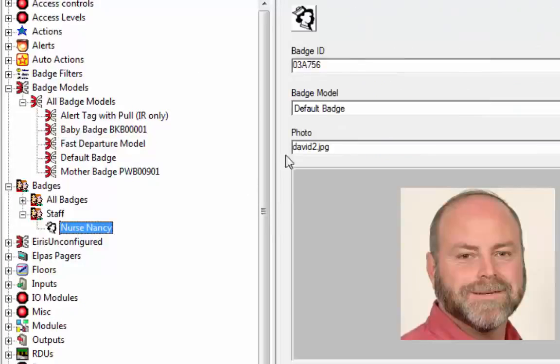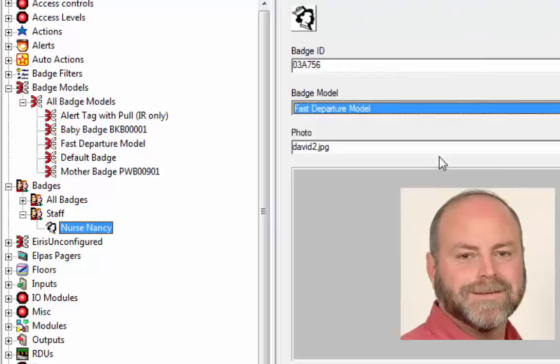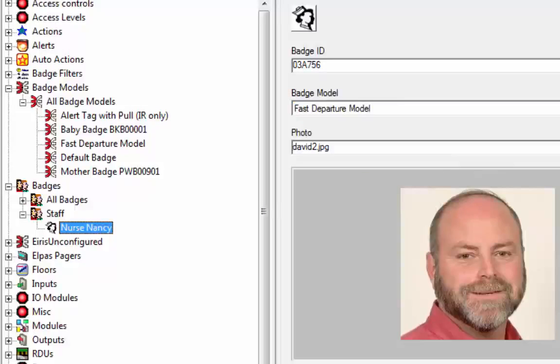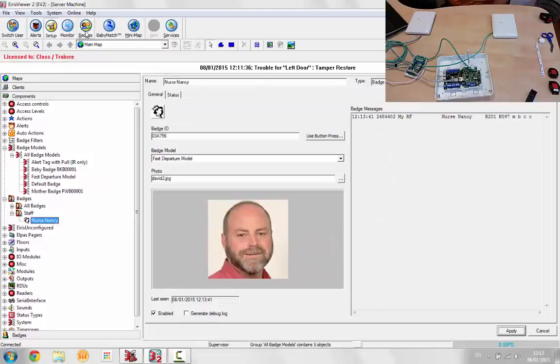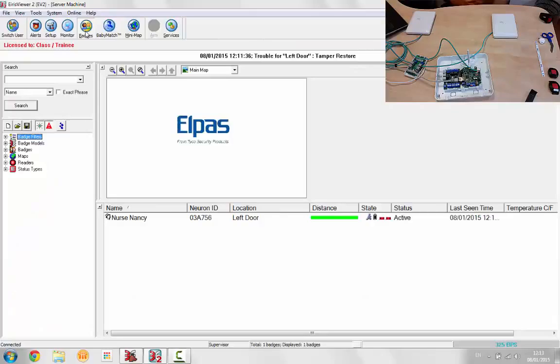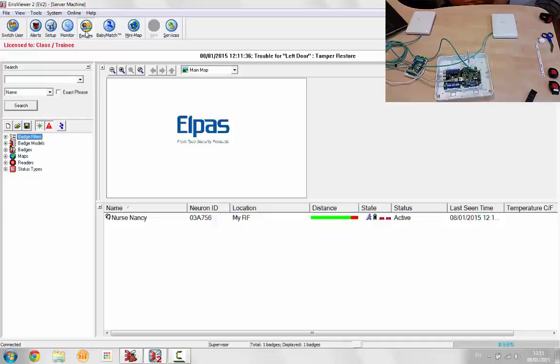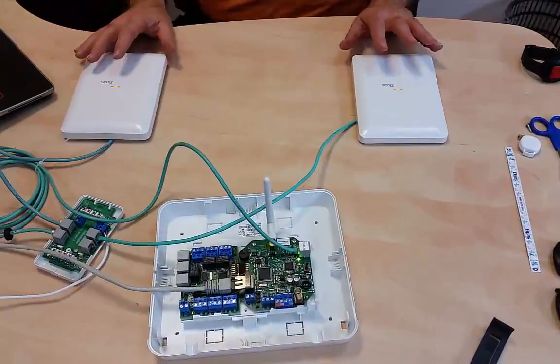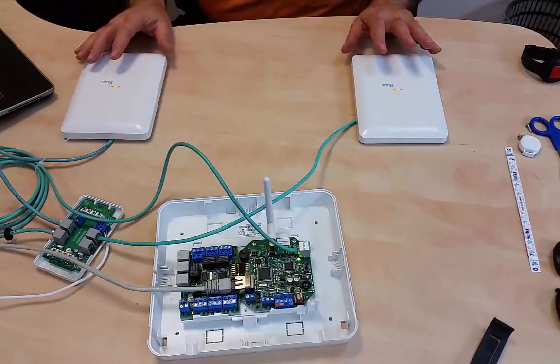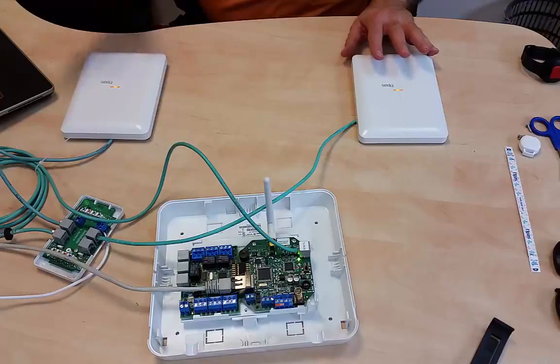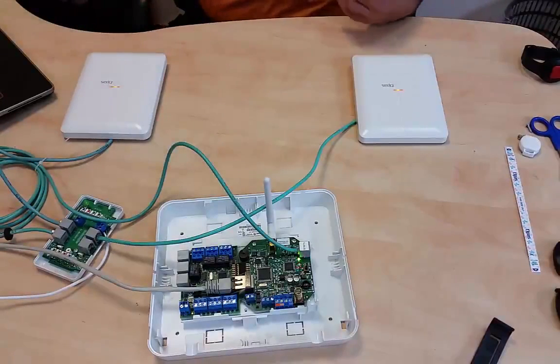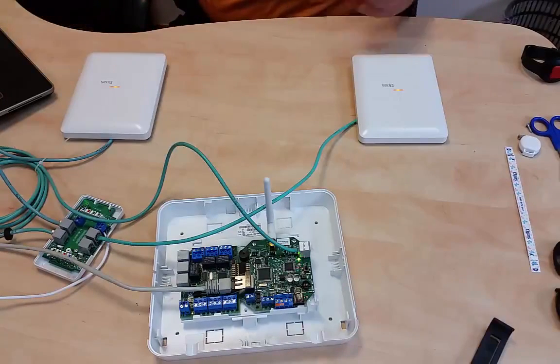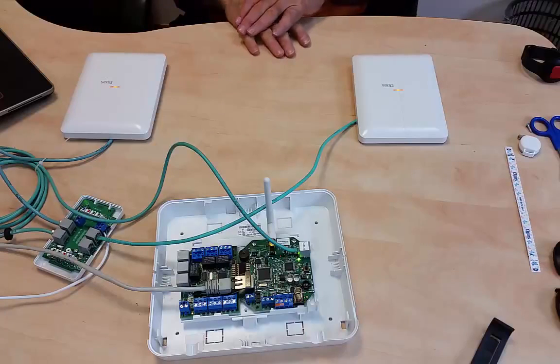And now I'm going to go to my badge. There's Nancy. And associate it with the fast departure model so that when it leaves the LF, it leaves the LF quickly. Move it into the left door and as soon as I move it out, it will relocate out my RF. And you don't have to wait five or ten seconds for that to occur. So now we have essentially three locations: the RF location when the tag is not under the LF and the two LF locations.